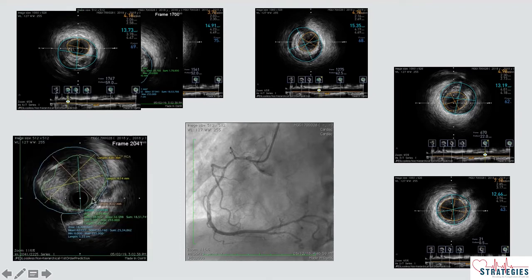So the ostium is relatively free, so in this case we can end at the ostium, or we can slightly project it into the aorta and stent it. And if you see the reference points at the ostium, the luminal reference diameters were almost 4.1 and nearly 3.5, 3.75 to 4, and EEM is almost 4.25.